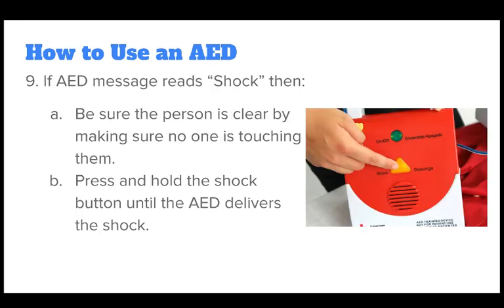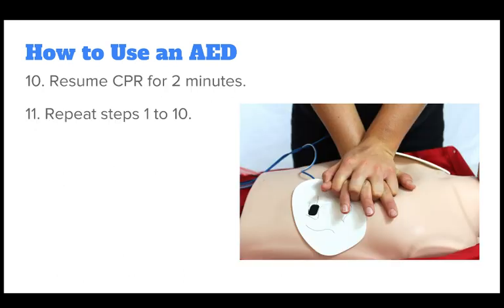If the AED message says shock, then be sure the person is clear by making sure no one is touching them. Press and hold the shock button until the AED delivers the shock. Resume CPR for 2 minutes, and then repeat steps 1 through 10.